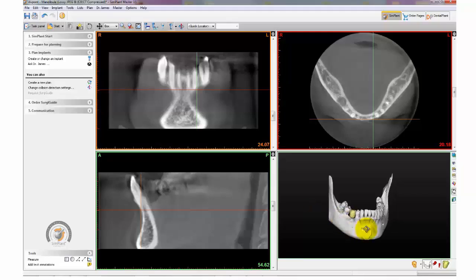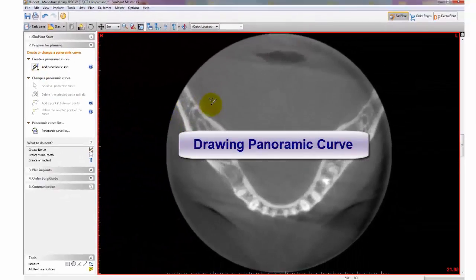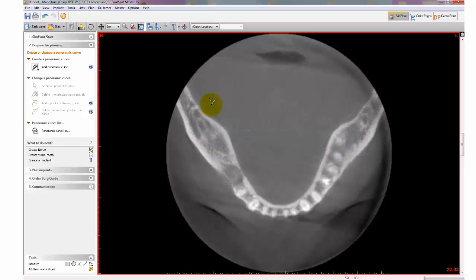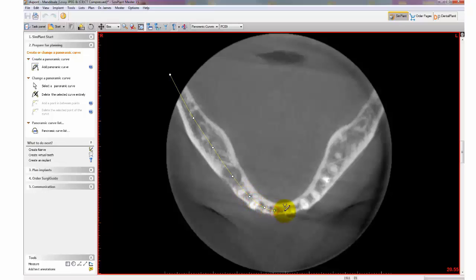Now let's move on to drawing the panoramic curve. Under Prepare for Planning, select Panoramic Curve. You can use your mouse wheel to scroll through the slices. Start off by clicking within the soft tissue and begin to click within the center of the bone. Slowly go around the arch and make as many points as you need to. To finish off, double click outside of the soft tissue.